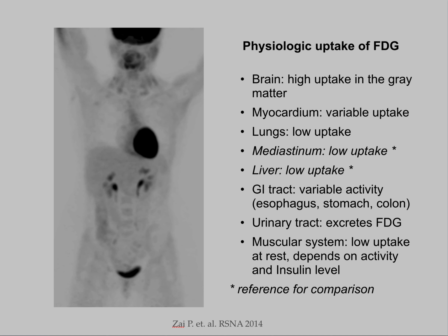So this is the typical physiologic pattern of FDG uptake. Brain usually is the most intense. It really likes sugar, as you can see. I have also observed that by giving candy to my own kids, the activity dramatically ramps up after administration of candy, so clearly brain activity goes up.